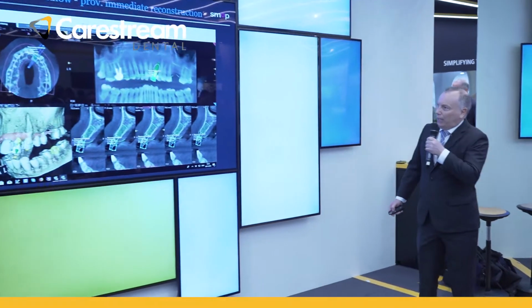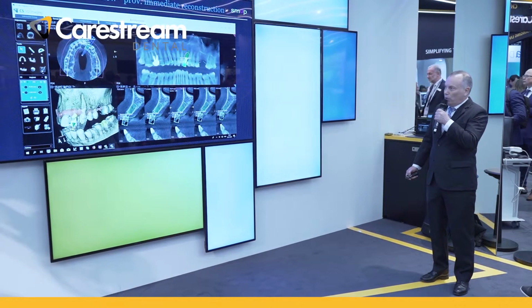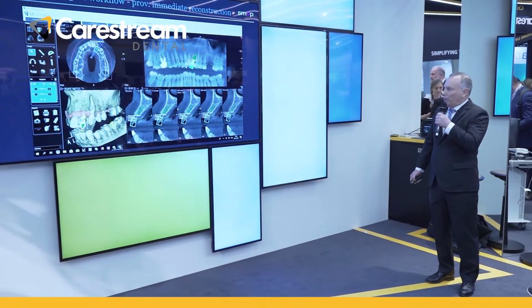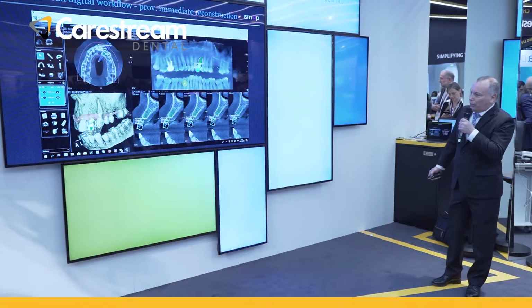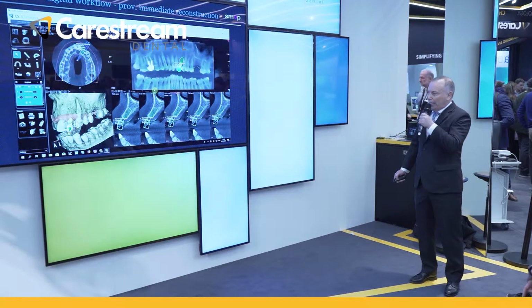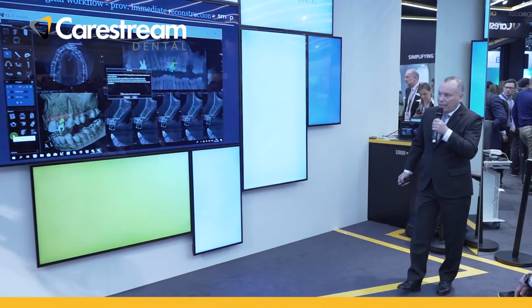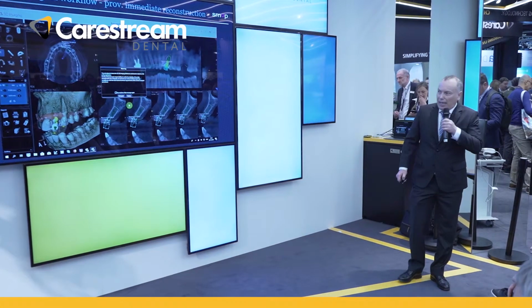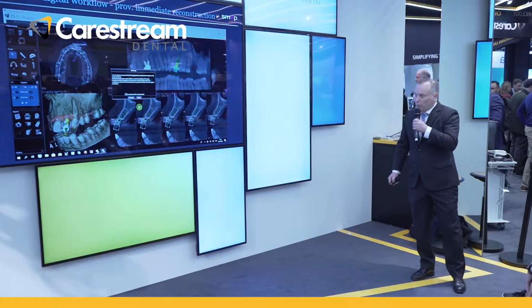So we have here the CS 3D imaging software. It's a small video I will show you. We see the panoramic view on the upper right, and on the left side, we see the volume. I have done a planning already here. We have the implants, and now we have the possibility to export this data, the volume, the DICOM data, and the position of the implant directly to the SMOP software.